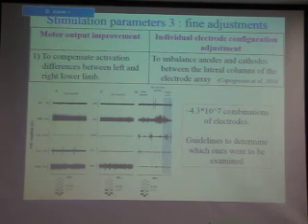Also, when these subjects try to stand at the beginning, we can have multiple issues. For example, there could be an asymmetry between the left and right leg, or an asymmetry between the amount of activity of proximal versus distal muscles. So trying to modulate which electrodes are active and how helps to fine-tune the muscle activity of the whole lower limb.